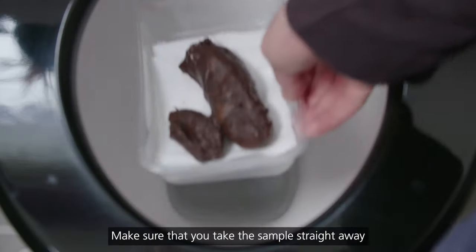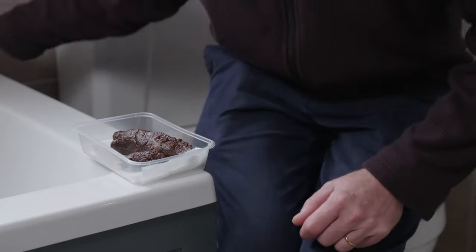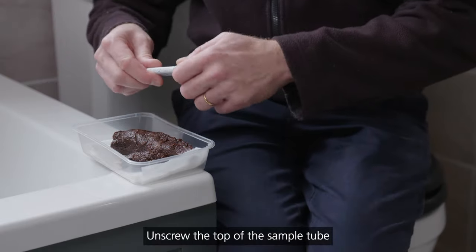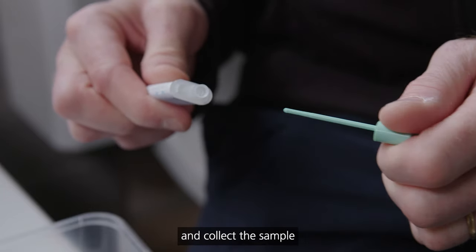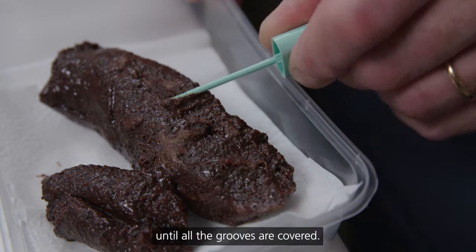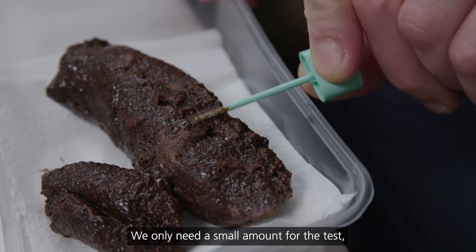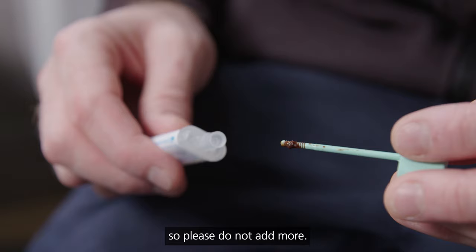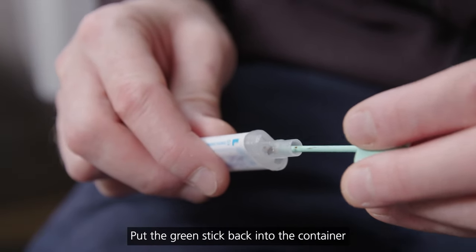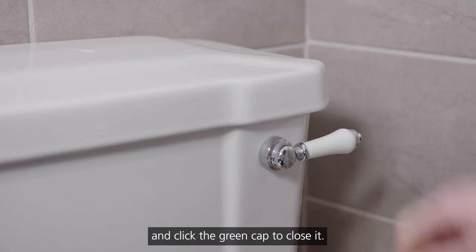Make sure that you take the sample straight away after you've passed the poo. Unscrew the top of the sample tube and collect the sample by scraping the green stick along the poo until all the grooves are covered. We only need a small amount for the test, so please do not add more. Put the green stick back into the container and click the green cap to close it.